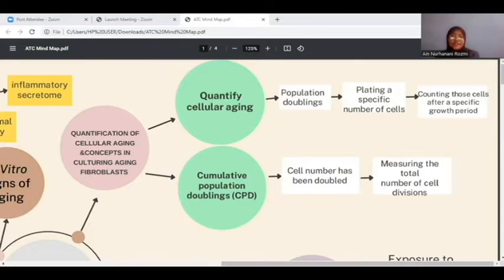The age of the cells is increased by one population doubling. For instance, 1.0 times 10 to the power of 6 cells are plated, followed by a growth phase and a count of 2.0 times 10 to the power of 6 cells. However, a more exact procedure is required for precision because even counts as I described above are rarely reached. So scientists are still in the identifying process in this situation.